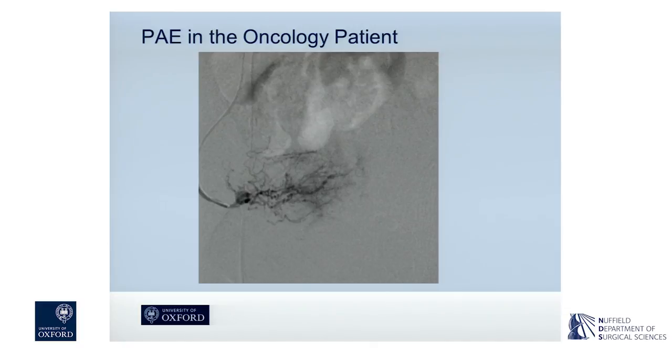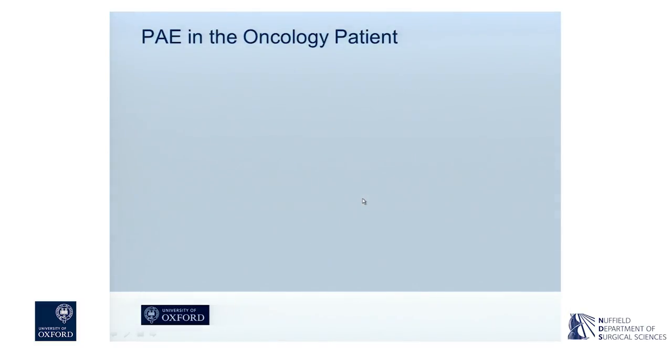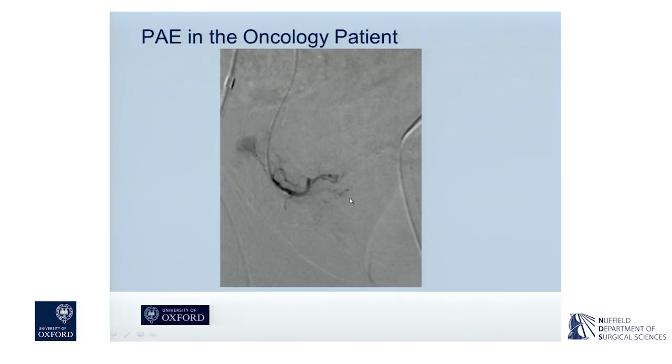In this case, we were able to selectively get into the main feeder to the tumor, and this is the hypervascular prostate cancer here, which correlated to the MR, and we embolized it, this time with just PVA particles. And you can see that that hypervascular supply is gone. All you're left with is the inflow prostate artery. And interestingly still, at the end of embolization, there was uptake within the metastatic nodal chains within that external iliac on the right pelvic sidewall.